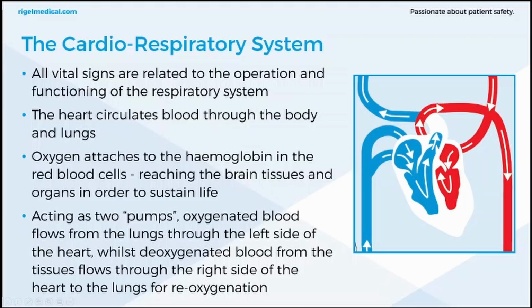And that really highlights all of the vital signs, except for SpO2. SpO2 just monitors how well oxygenated the blood is within the body, and it does this by using pulse oximetry, which just monitors the levels of oxygenated blood compared to deoxygenated blood. But we'll come on to that in the measurements section of this webinar.